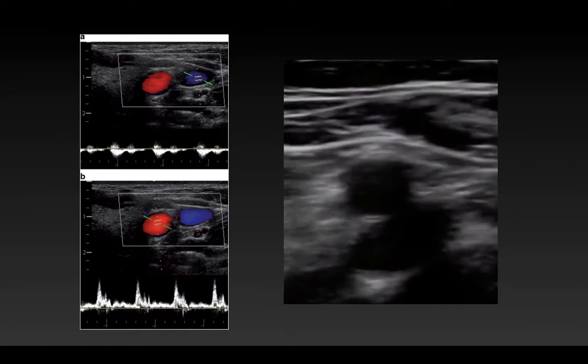If you're not sure which vessel is the artery and which is the vein, you can confirm this using pulse wave Doppler. On the left side of the screen, in image A, you'll see the pulse wave tracker is over the vein, showing venous pulsations. In image B, it's over the artery, and you have a classic triphasic arterial waveform.